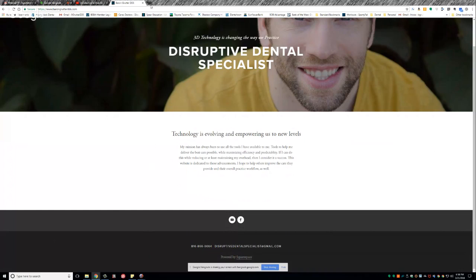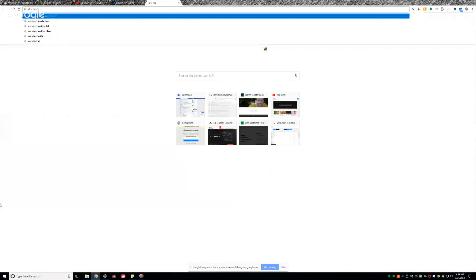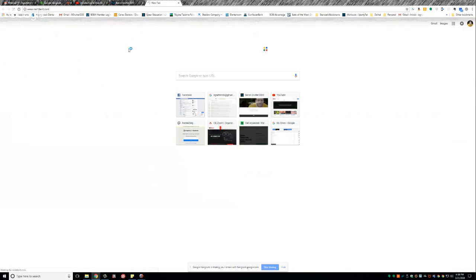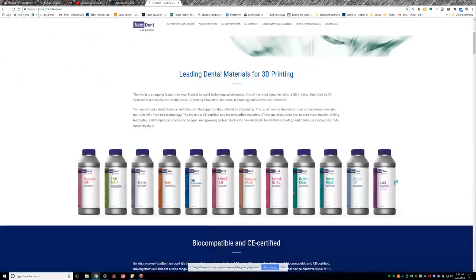Okay. Which ortho IBT material are you using? Nextdent Ortho IBT. Nextdent is the brand. Sorry, my internet is really not great. Here we go. So yeah, Nextdent Ortho IBT, and I know that Sprint Ray was selling it. I don't know if they still are or not, but that's who I've gotten it from.